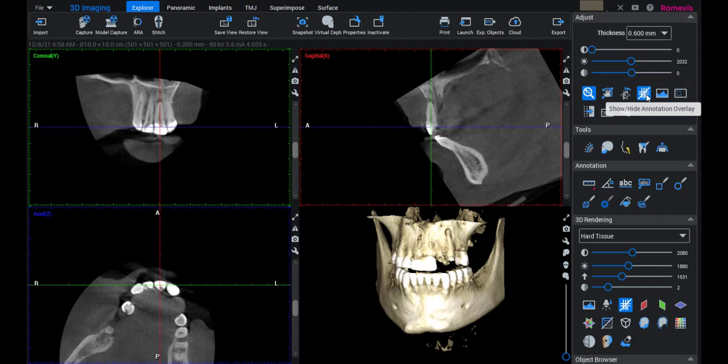Now I'm going to turn off the annotation so you can see exactly what's going on with the tooth, then I'll turn that back on.